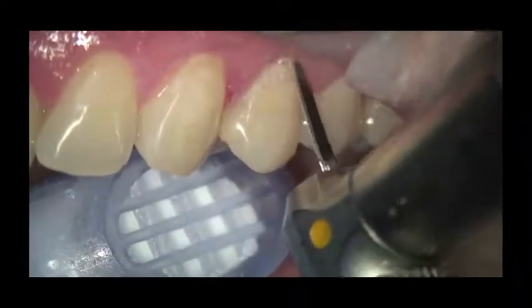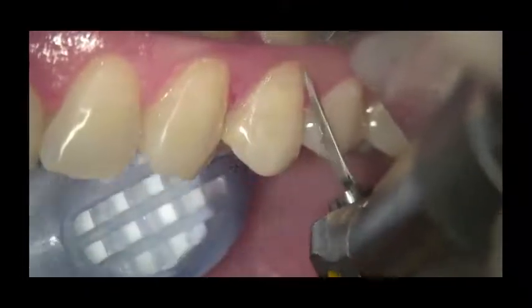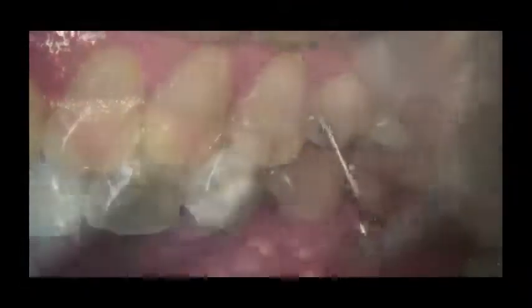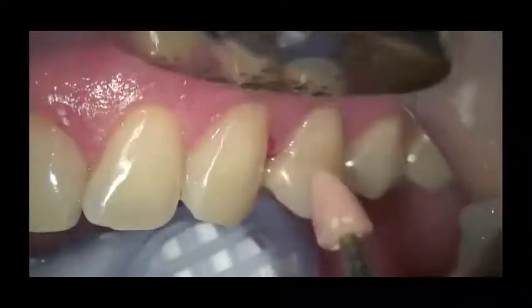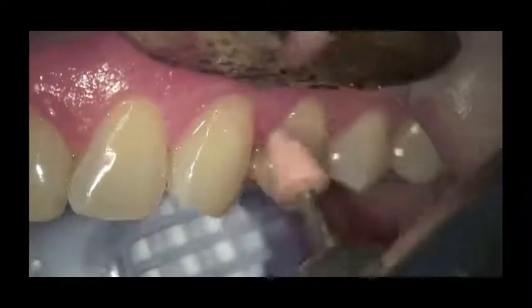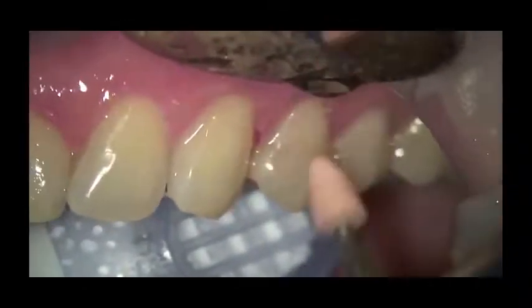And this is really good for Class 2 restorations also, interproximally, because you can gouge the root surface if you go in there with a rotating diamond or carbide, but with this you generally cannot damage anything. And then this is just a final polishing point. These are Renamel's polishing points, or Cosmodent's polishing points. And that basically walks you through the system that I use. It's fairly predictable and simple, and I find that I'm getting really good long-term results with that system.